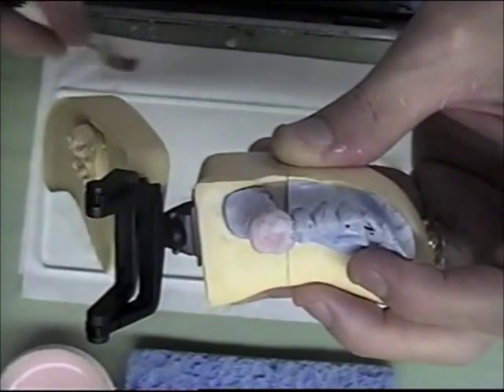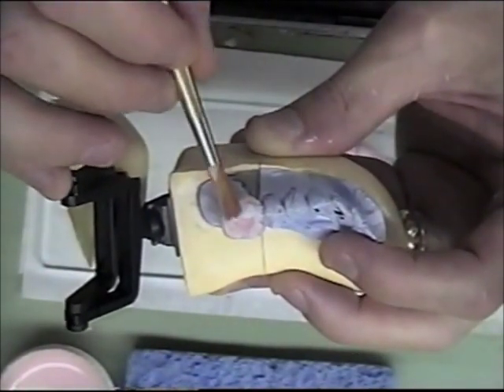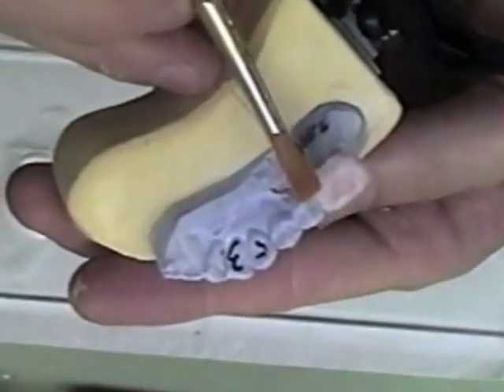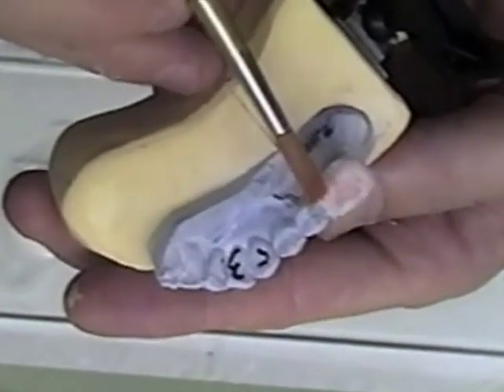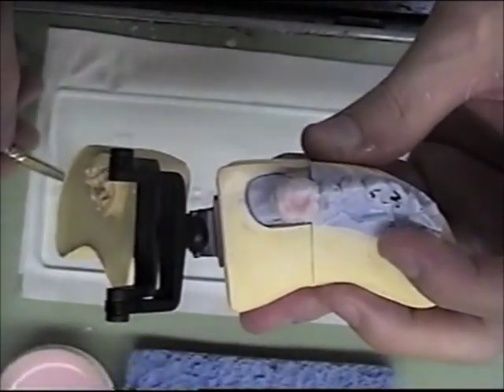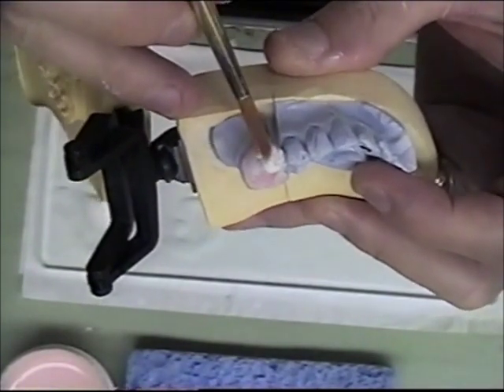That's all I do there, and you can do a little blending if you like. Then at this point I add my luster and break.